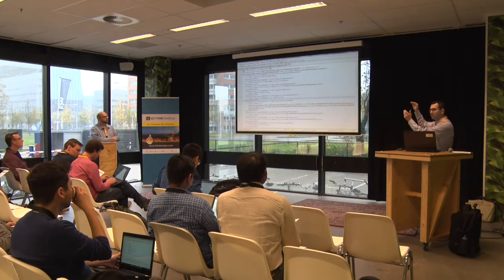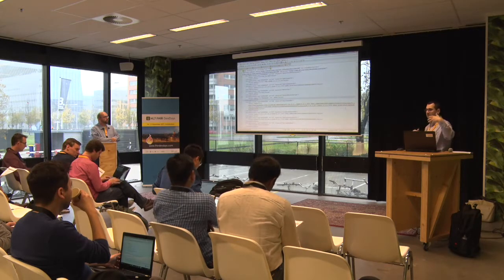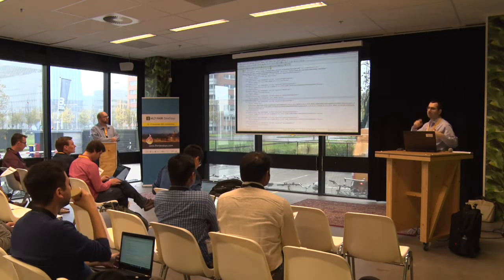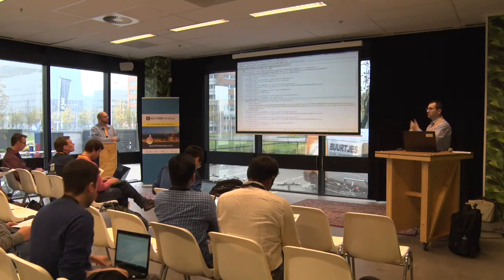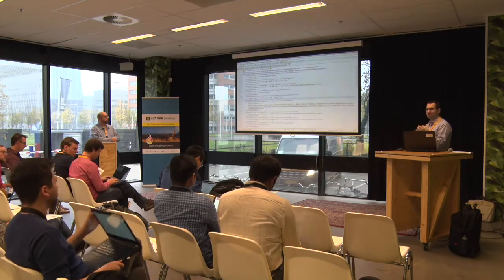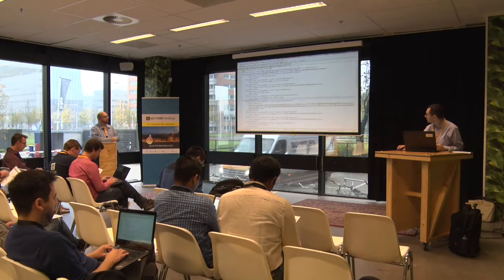So the information you'll get here is different from what you're going to get at the patient level. At the patient level you'll be interested in things like the patient's age, potentially address, that kind of stuff. Here you're interested more in the study. What time was the study done? What modalities, so what kind of devices were involved in the study, and so on and so forth.